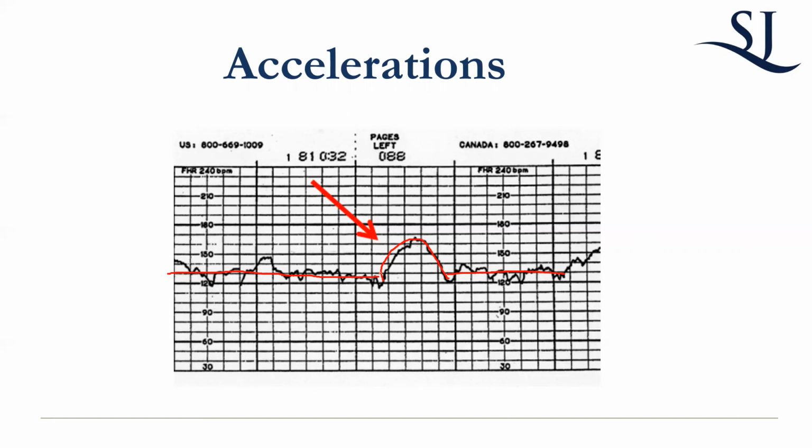Yeah, it has to be for at least 15 seconds. Accelerations, you don't generally describe their duration because it kind of doesn't matter. If they're there, great. The reason they have a definition is because sometimes you'll have an artifact that goes like this, or like a blip, and that's not indicative of reassuring fetal status. That's just an artifact. That's the reason they give it a definition.